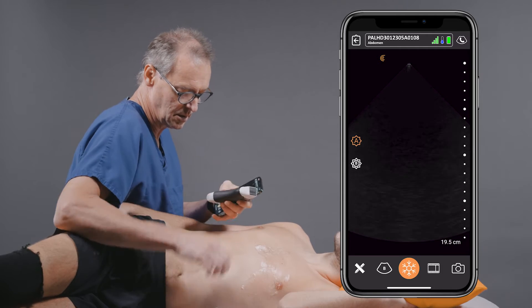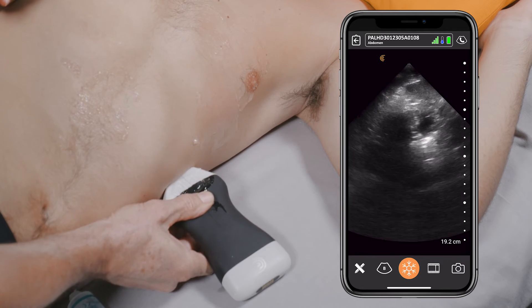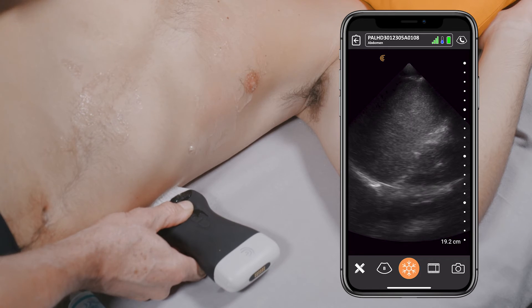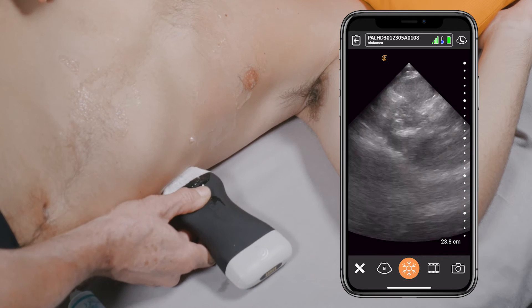Next, we'll move to the left upper quadrant. Once again, what we'd like to do is look above the diaphragm in the left hemithorax so that we don't see any evidence of free fluid there.